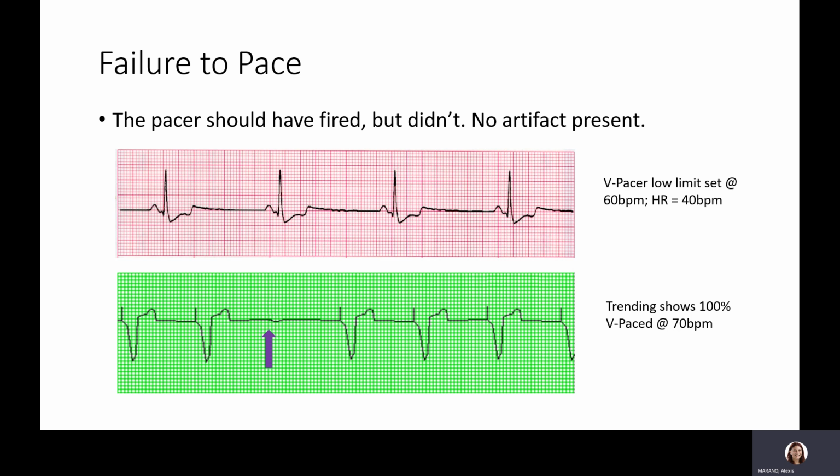For the purpose of the exam, you would probably be able to see the one on the bottom more so than the top one because we'd have to give you a lot of backstory. The reason why I share this with you is you may get to your floor and find out that your patient has a pacemaker and they're not actually pacing when they really should be. That pacemaker would need to be interrogated.